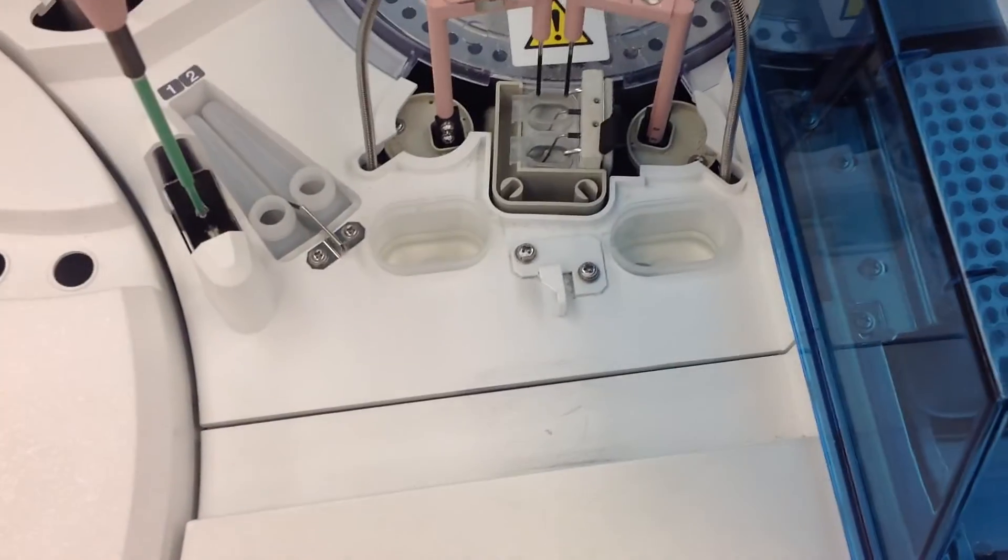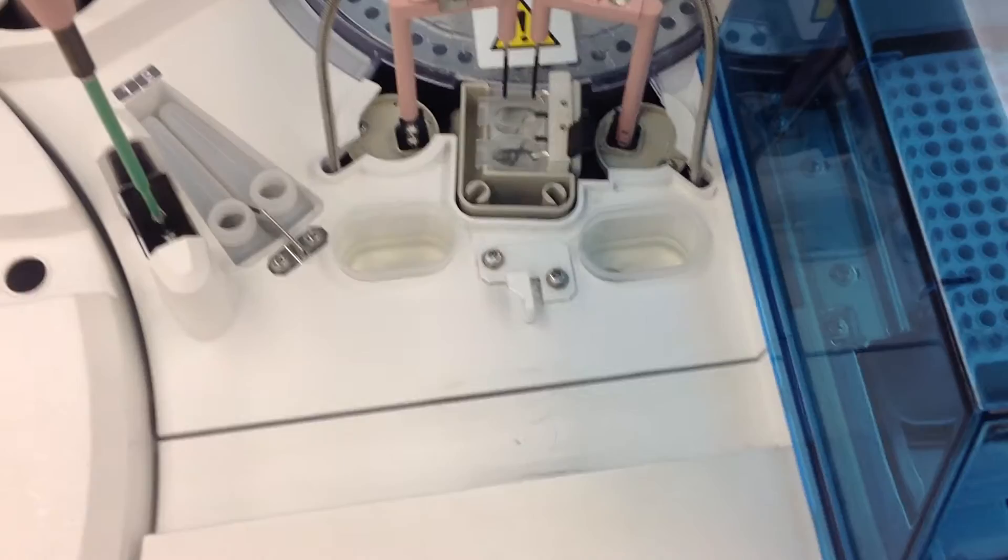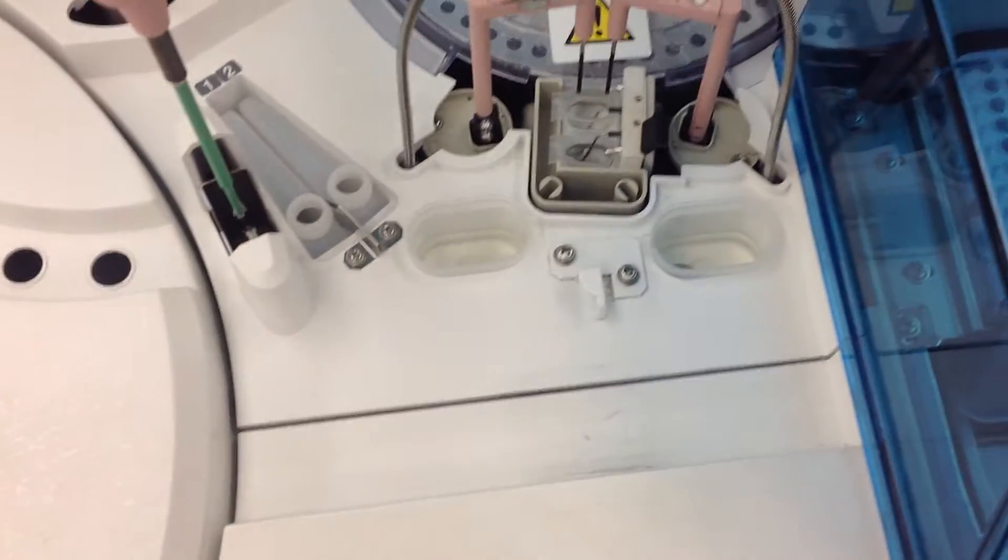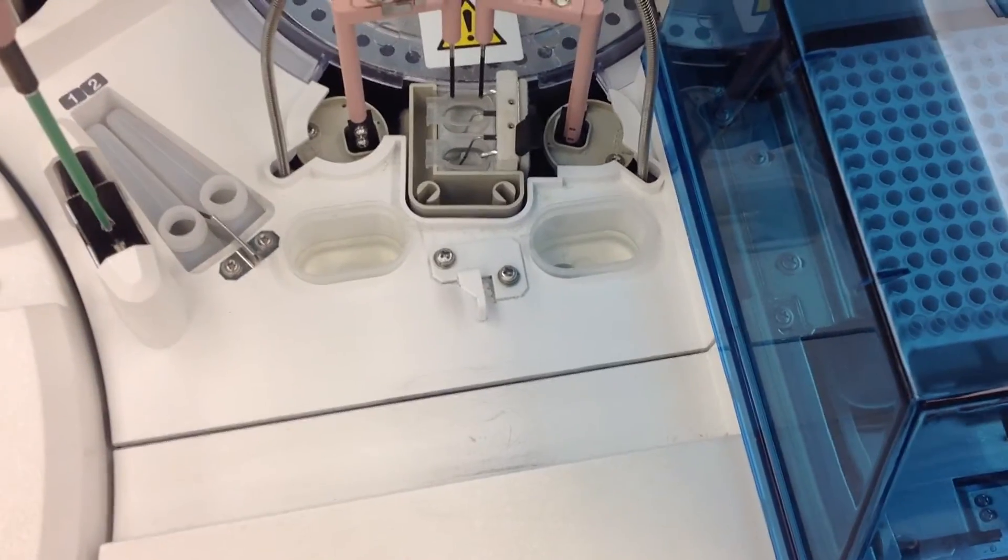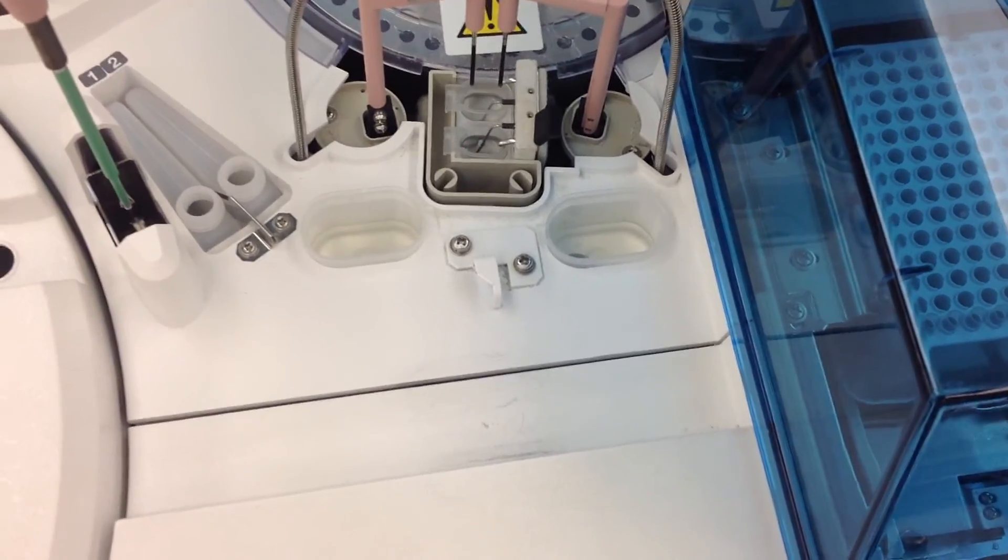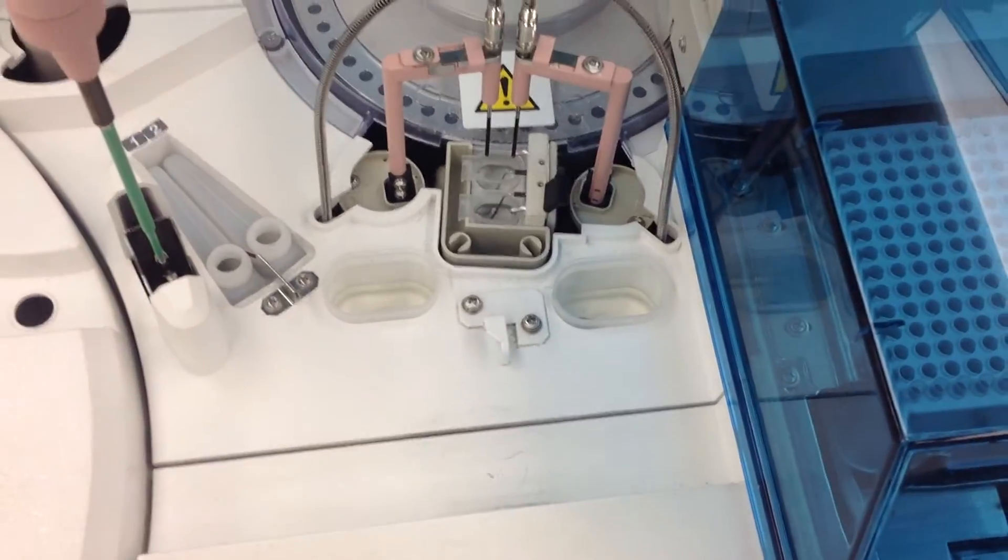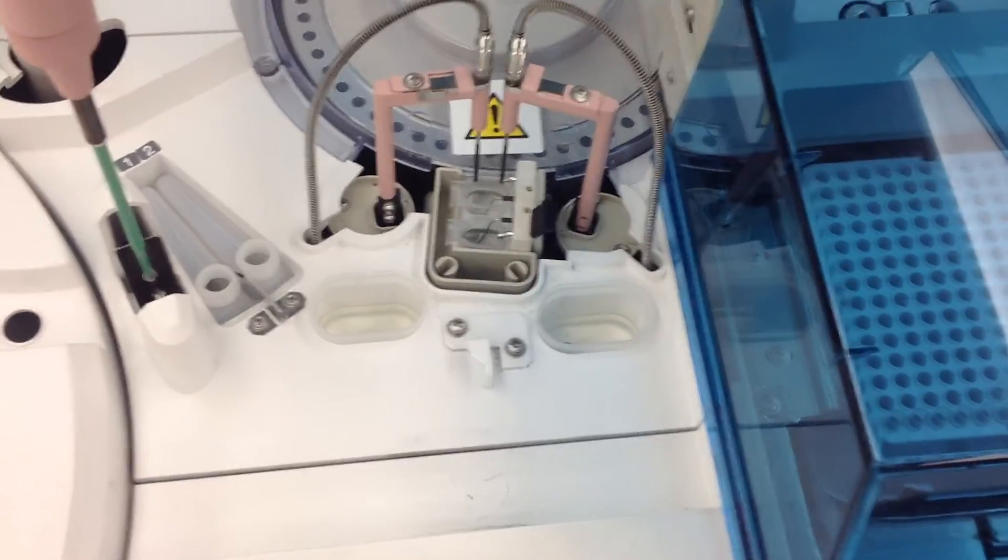Then you just go ahead and put those back in there. You want to make sure that those containers are clean before you add the solution, which I did before I started the video. Then just go ahead and close your lid.